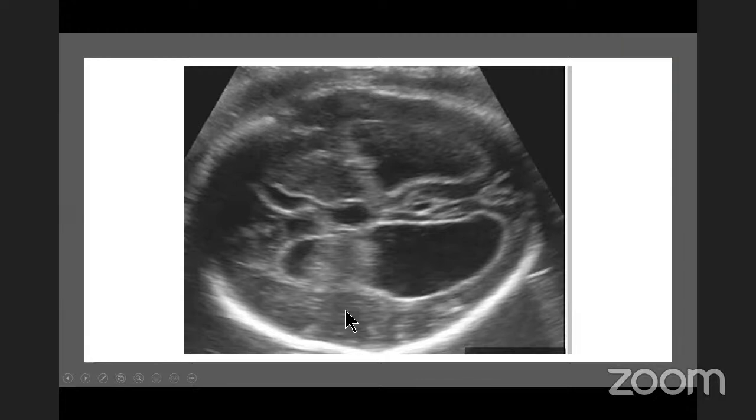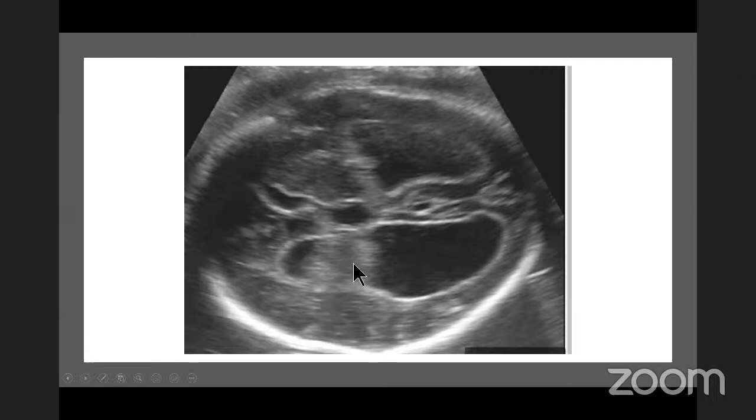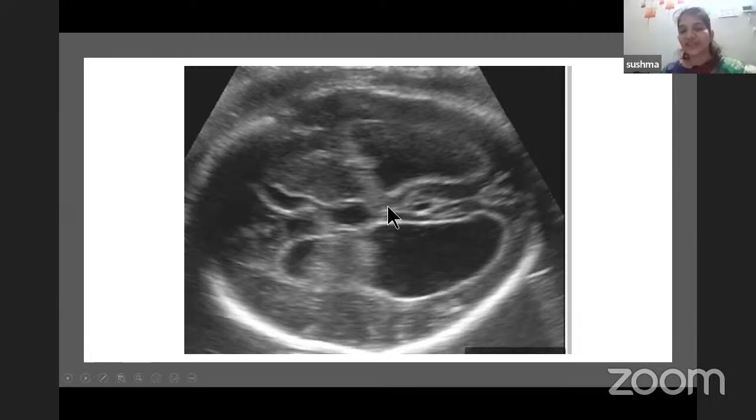And we do have 3 answers from Dr. Jeevan Jyoti. Yes, Mallika Sunil Joshi as ventriculomegaly, and Dr. Priyanka encephalocele. Okay, so this is actually a case of ventriculomegaly. Thank you everyone for answering.